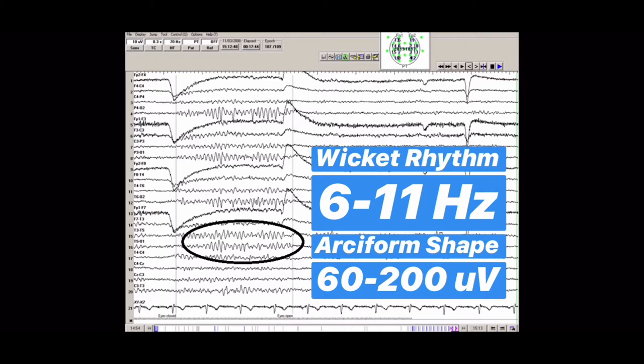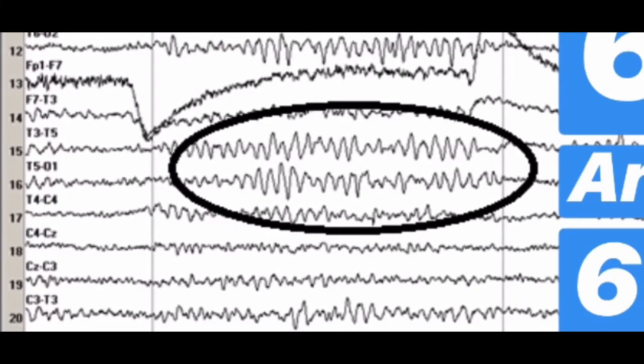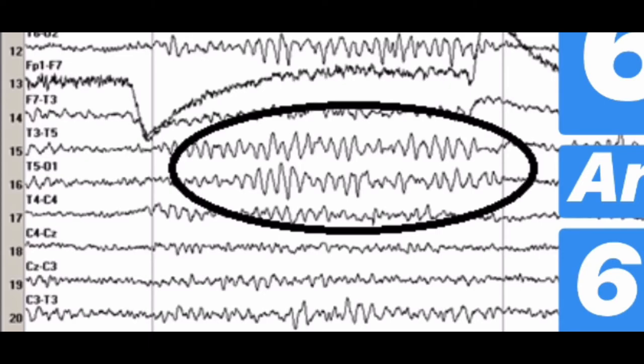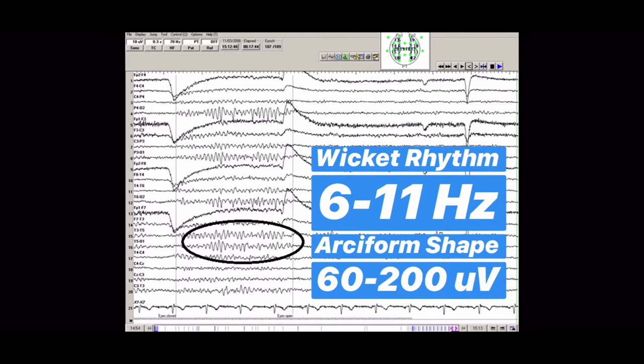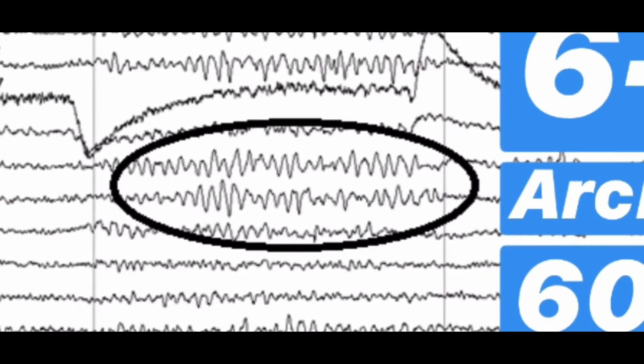Now let's look at some actual EEG patterns of wicket rhythm. Here's a good example from eegpedia.org. You can see it has a nice arciform shape just like mu rhythm, and it's coming most prominently from the T3 to T5 electrode, in the temporal regions. The frequency is between 6 and 11 waveforms per second with 60 to 200 microvolt amplitude — the shape is clearly arciform.